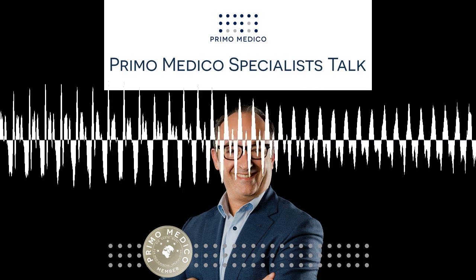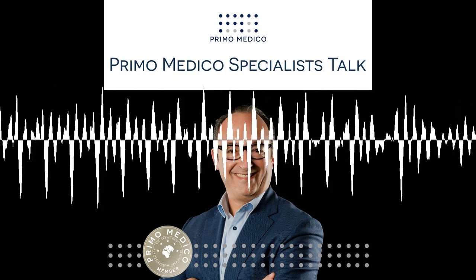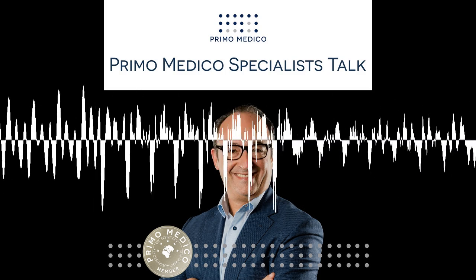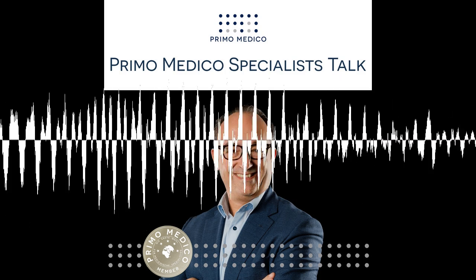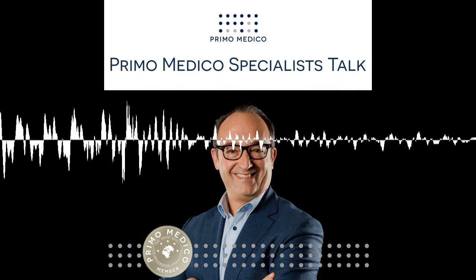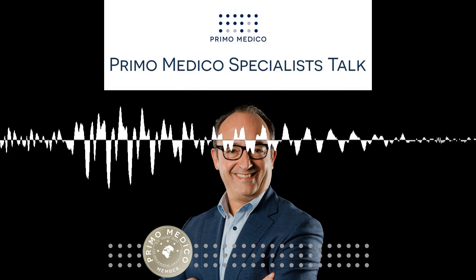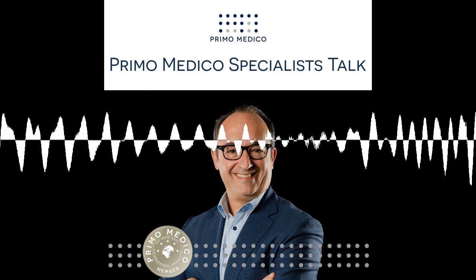Could you please explain how a total ankle arthroplasty works? What parts of the joint does it replace? Yes, total ankle arthroplasty is in principle a reconstruction of the arthritic surfaces. That means the tibia, the lower leg bone, and also the talus, the foot bone, are resurfaced. And here we have two options, like in the knee arthroplasty. The one is where the plastic inlay between the tibia and the talar component is mobile. We call it the mobile bearing total ankle arthroplasty, versus the fixed bearing total ankle arthroplasty, where the inlay is fixed to the tibia component.